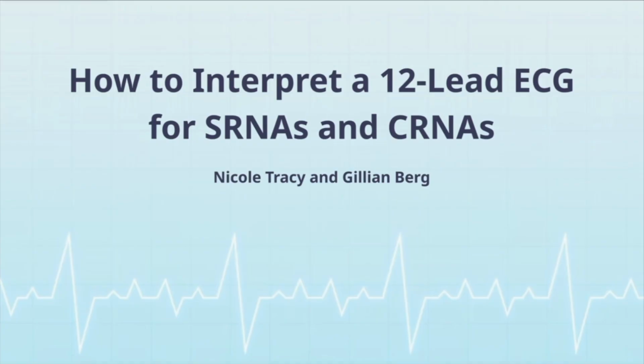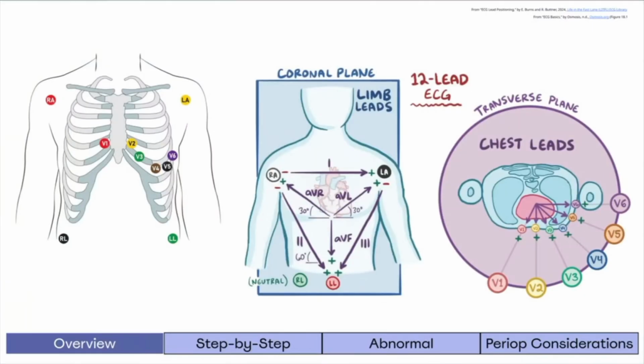Electrocardiographic interpretation is utilized across the entire perioperative period. Often ECG changes are one of the first indications of cardiac compromise, making it essential that SRNAs and CRNAs are able to recognize and treat these changes.